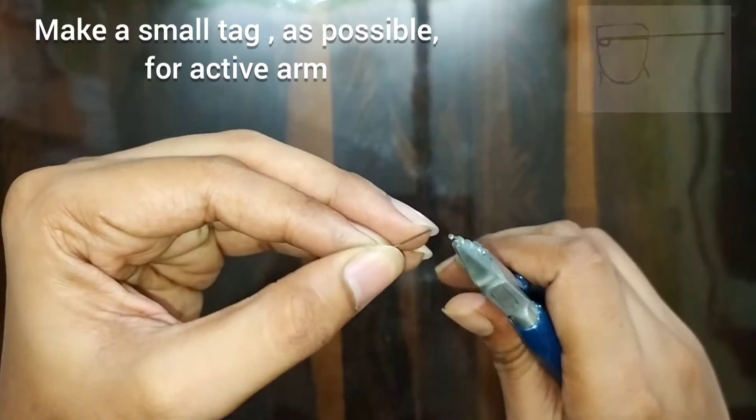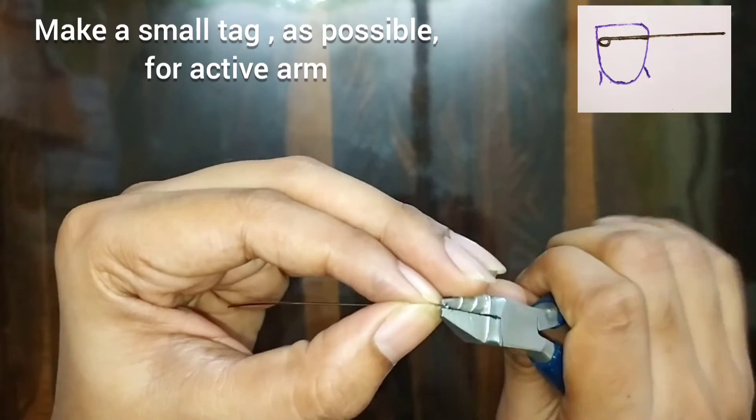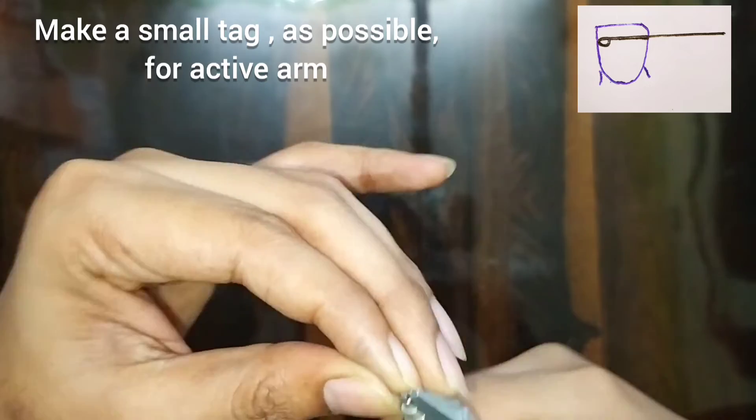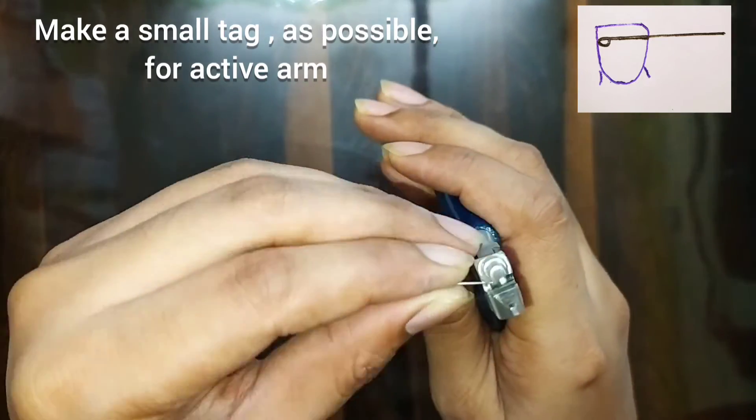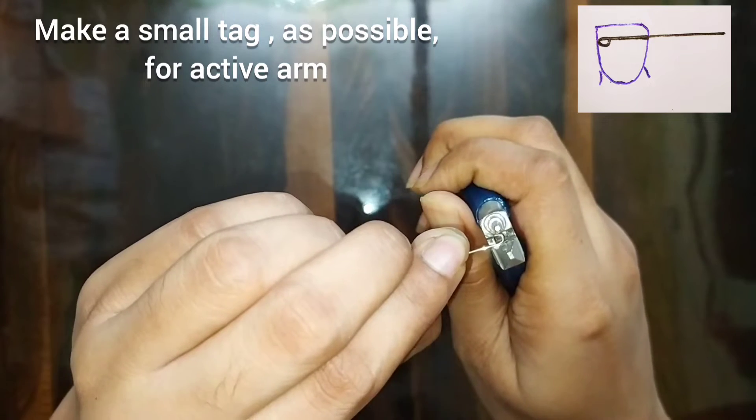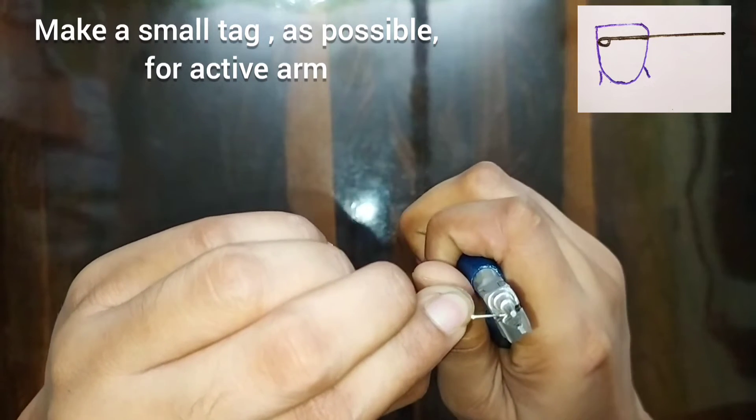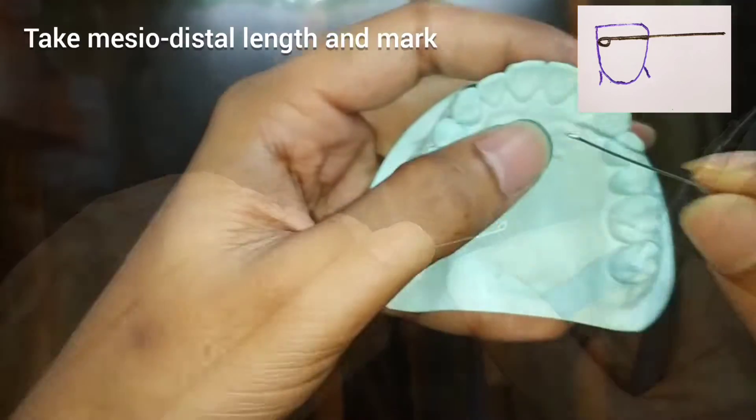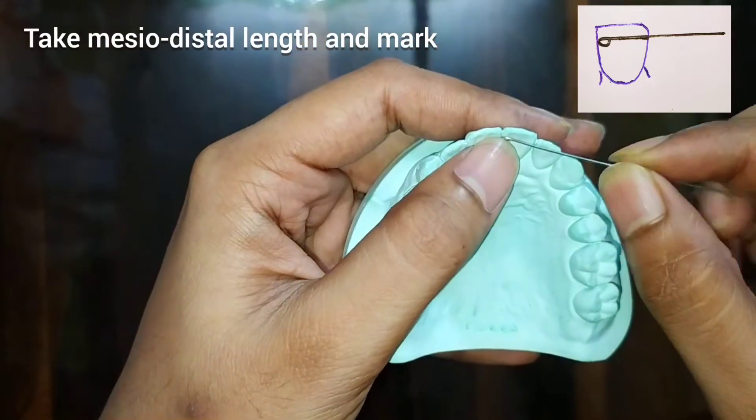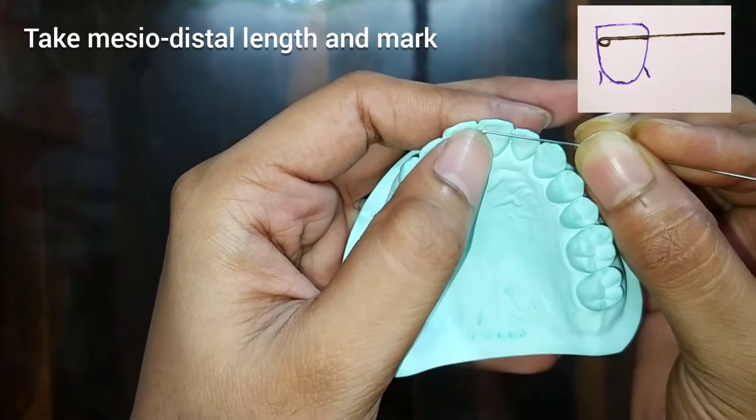First, we will make a small tag at the corner of the wire. Make it as small as you could. This will form the active arm of our Z spring. Keep the active arm on the central incisor. The tag should face towards the mesial side.